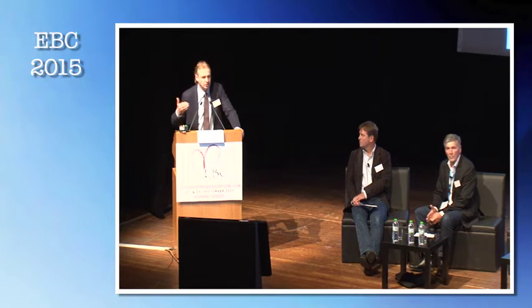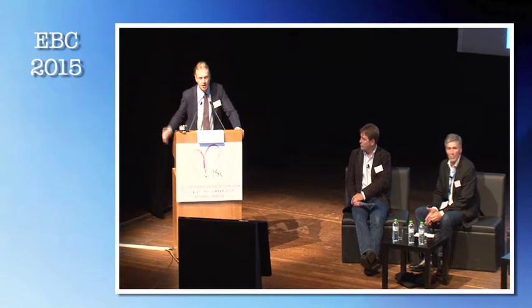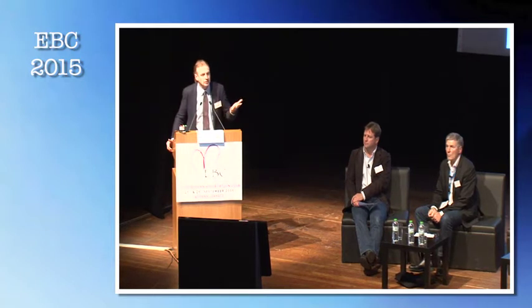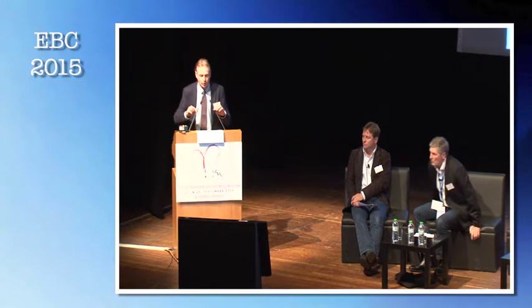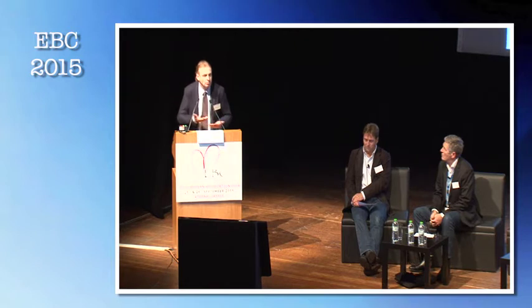I'm not sure that with nowadays technologies, and maybe Patrick can comment on this, what we use here, IVUS or OCT, we can even say what is there. Is this substrate, is this the scaffold material, or something different, and how will it transform? But actually we analyzed this segment, and there are no problems. But the question again is what we discussed inside the lab: what do we really do, is it a mini crush or a T-stent, which is also a bit like some mini crush?